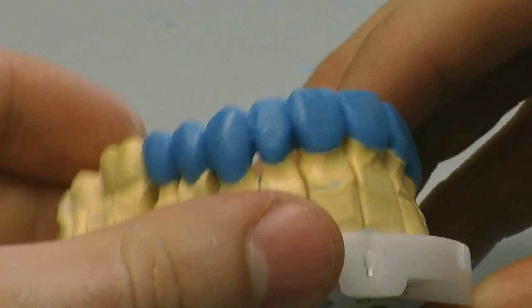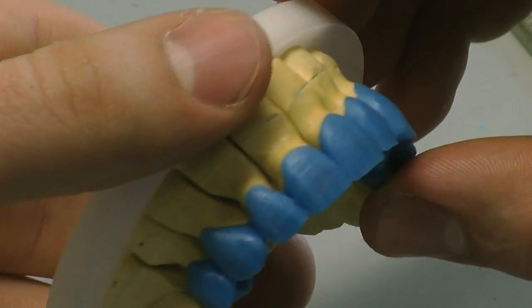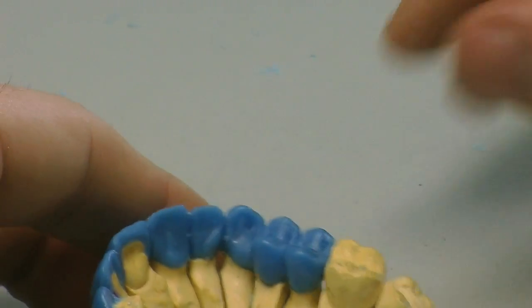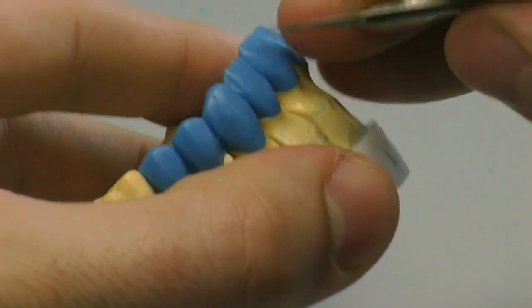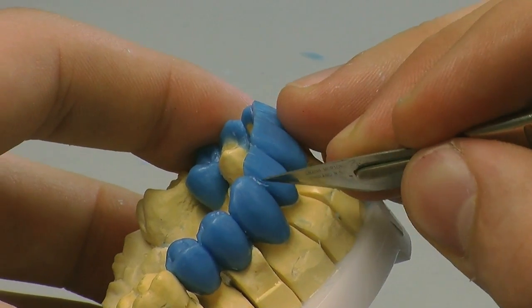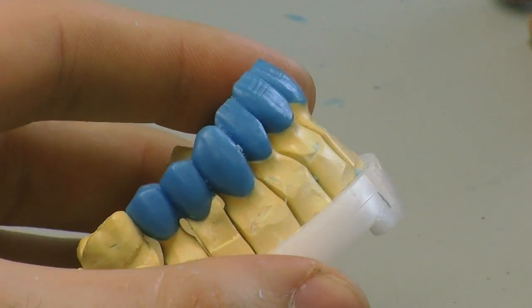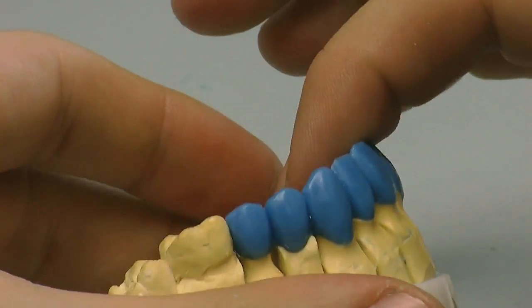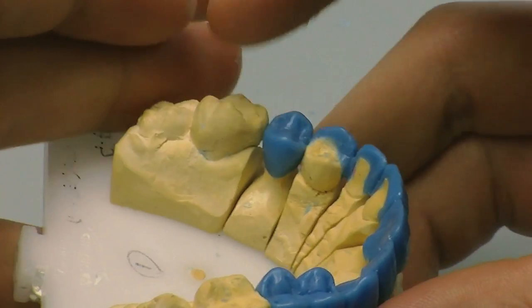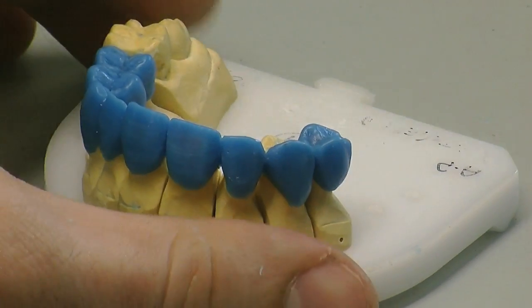That's really good. So now we've verified our occlusion. We know our fit's really good. Our protrusive is good. Our left and right lateral is good. So now what we're going to be doing, we're going to be sectioning through the wax ups. So effectively now, we're just going to be cutting through and preparing the margins for the individual investing for the pressing process. So we're going to take the model apart and now start sectioning through with the blade.